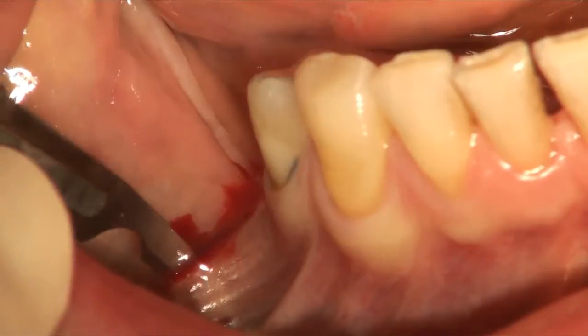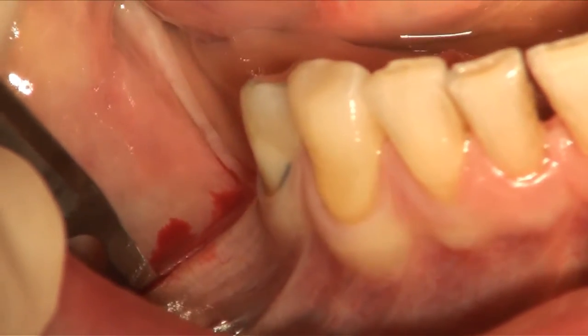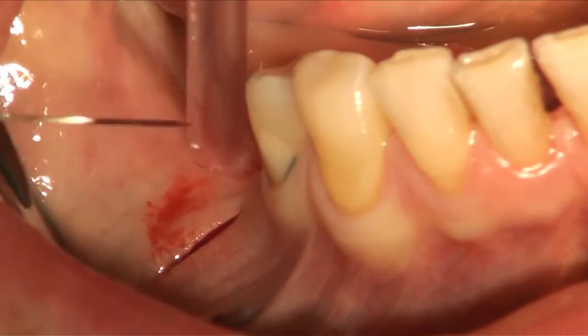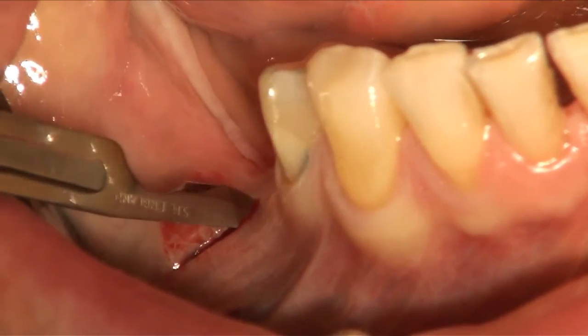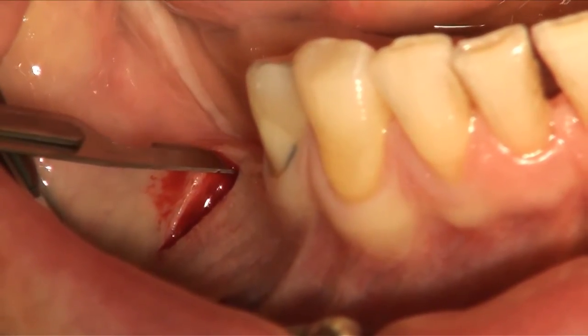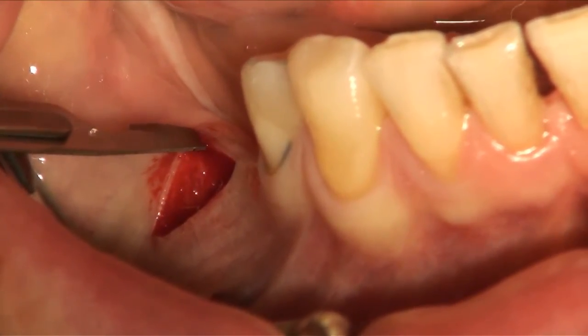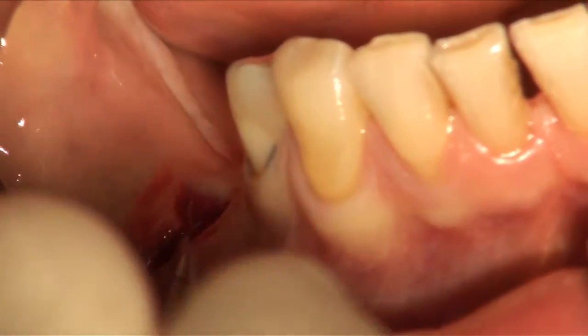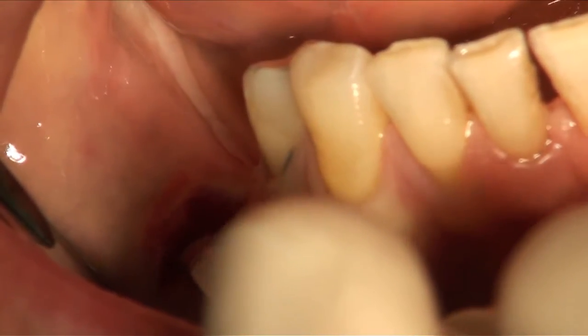We stay in the connective tissue. We make a little bend to the distal aspect for better access. And then we begin to split the connective tissue.